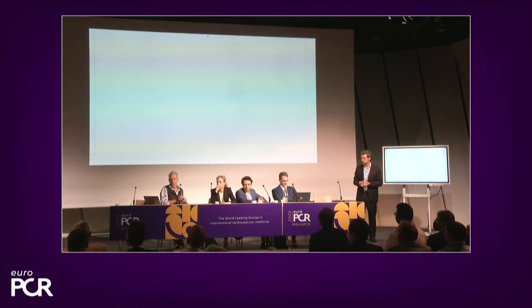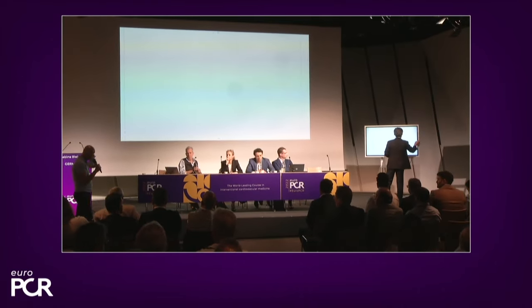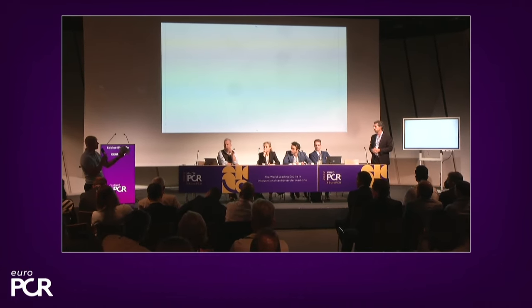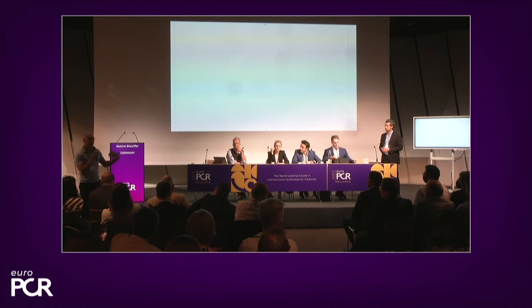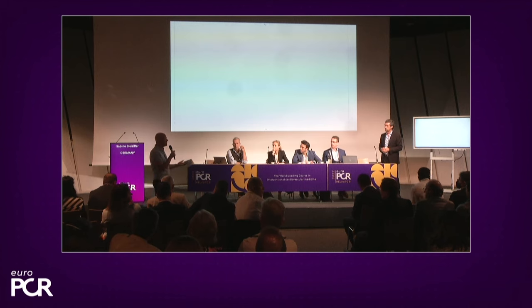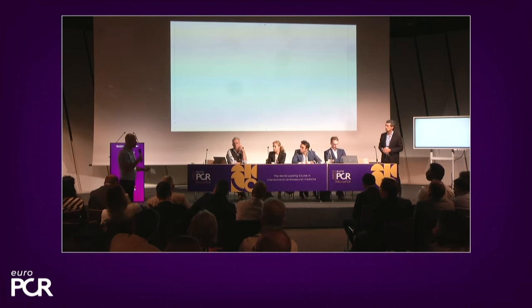Yeah, well, there's not that much time, but we can briefly go into that. So I, you know, in Optimize PRO, basically used explicitly the cusp overlap view. It introduced six different aspects of that technique. And by following that, eventually the result was that your pacemaker rate was dropping below 10%. And also no PVL involved and no issues with coronary obstructions and so on. So I think mission accomplished in that regard.